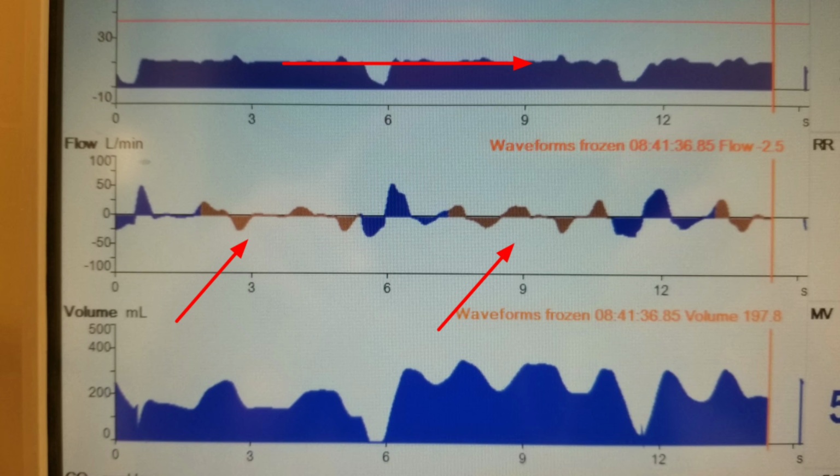So this is a ventilatory mode where the patient can breathe spontaneously throughout the whole respiratory phase. Therefore, when they're in P high, they should be able to breathe quite comfortably, because the whole point of the CPAP level, that P high, is to put them into a corrected FRC where they're able to breathe on the pressure volume loop, as mentioned before, in the most compliant areas, okay? It can also be used in an apneic patient as well.